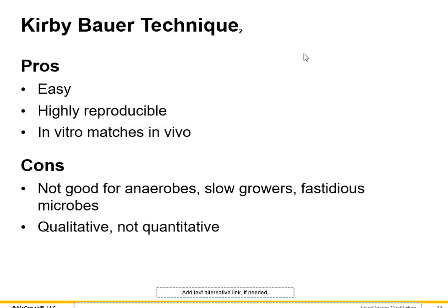It's also highly reproducible, right? So you can keep on culturing your bacteria and get the same results over and over again. And in vitro matches in vivo. That basically means that what you see happening on the plate is what happens in the body.